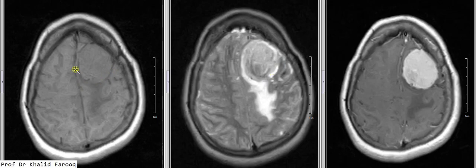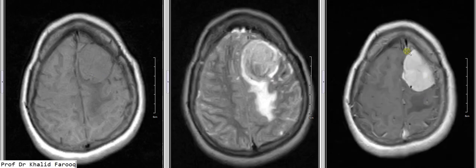This is a very important point — with this point we can say that this is an extra-axial mass lesion. Considering the intense post-contrast enhancement and meningeal-based lesion, we can say that this is clearly a meningioma.